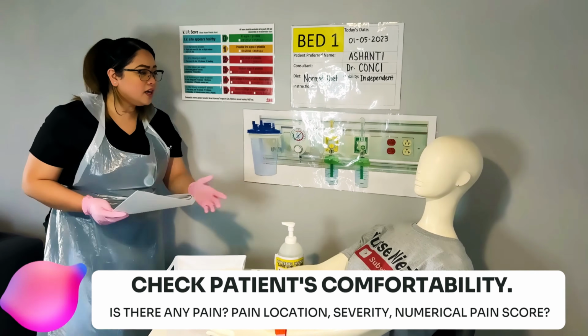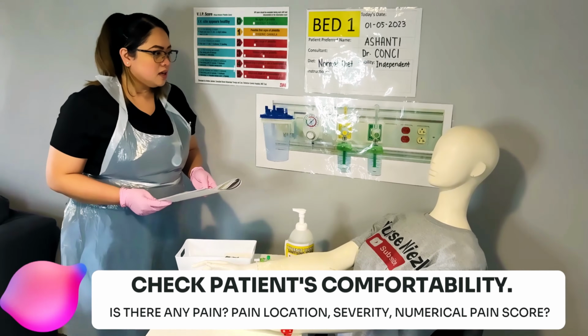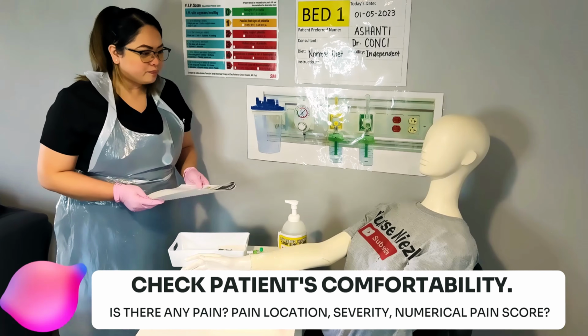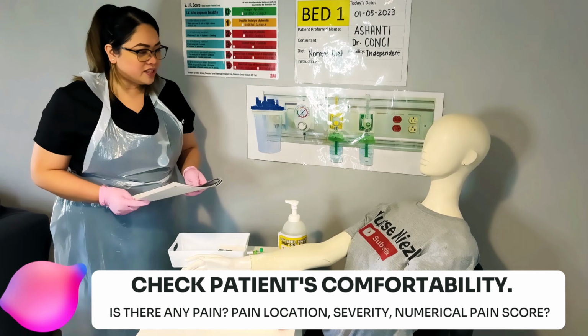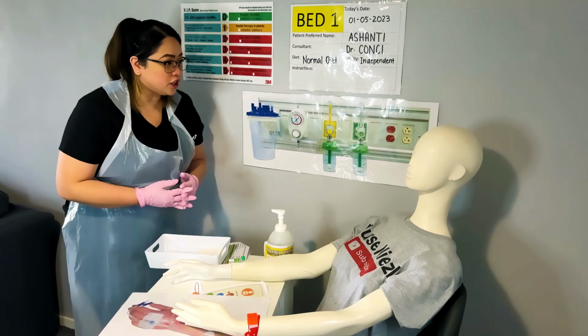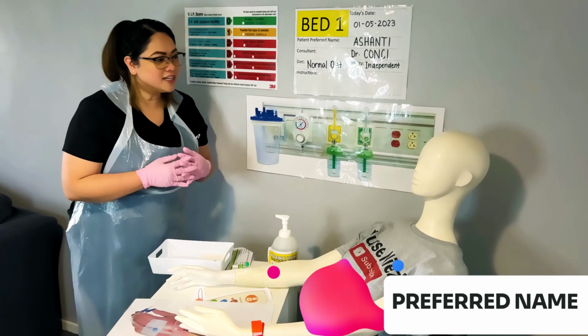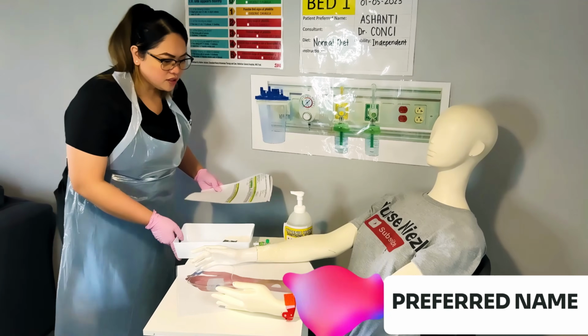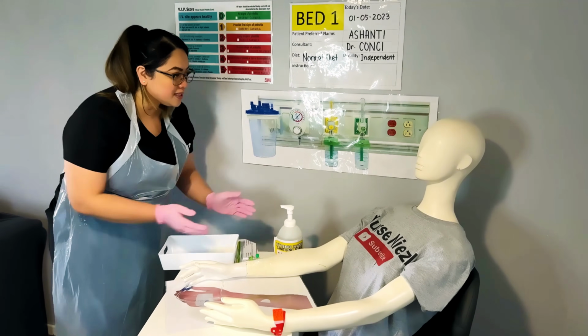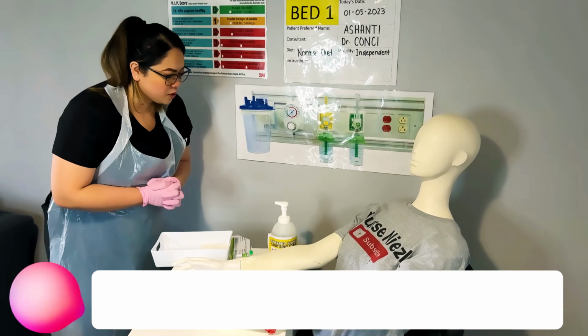So are you alright? Are you comfortable? I am comfortable. Okay, do you want me to reposition you or anything? No, I'm okay. Alright, okay. So would it be okay if I proceed? Yeah, sure. Okay, before I start, what do you want me to call you? Just call me Ashanti. Okay, Ashanti. So the first thing I'm going to do is a VIP assessment, if that's alright with you. I just need to assess your cannula at the moment, okay? Would it be okay? Yeah.